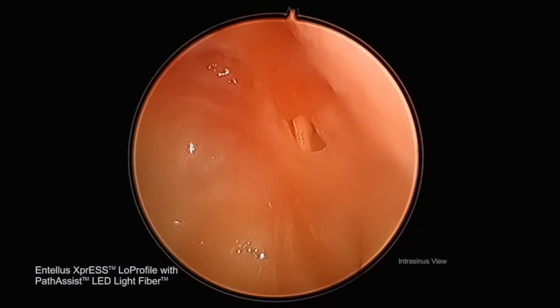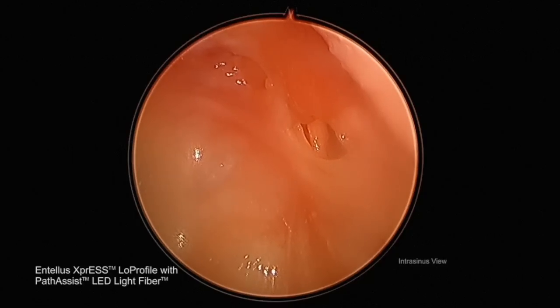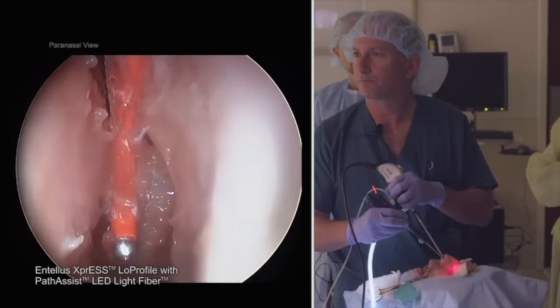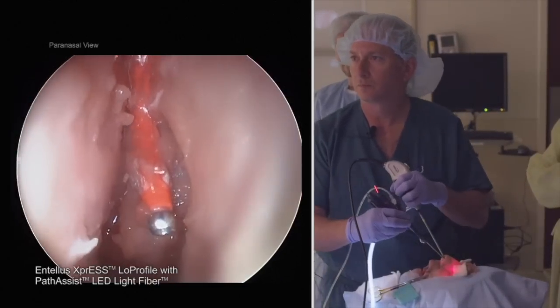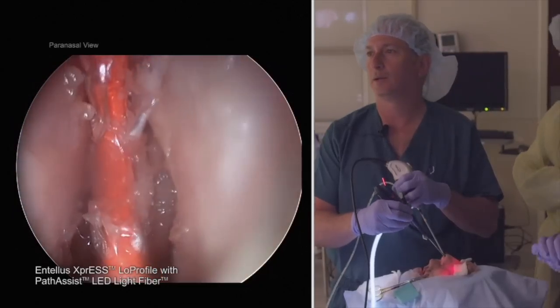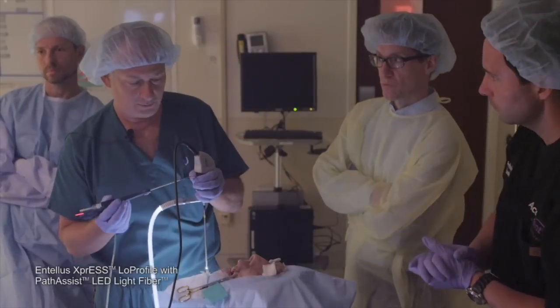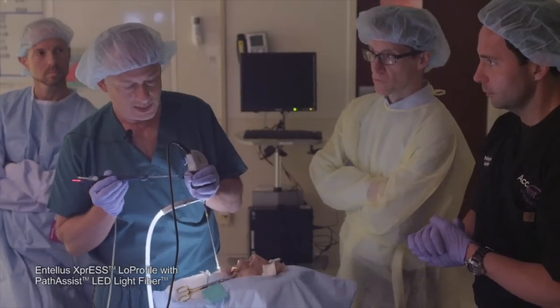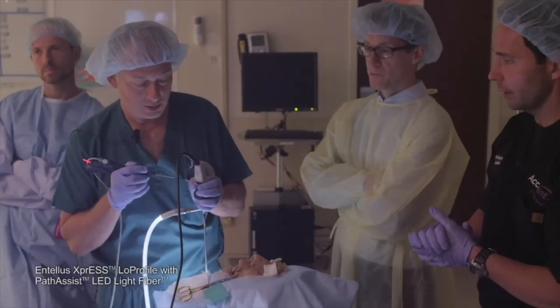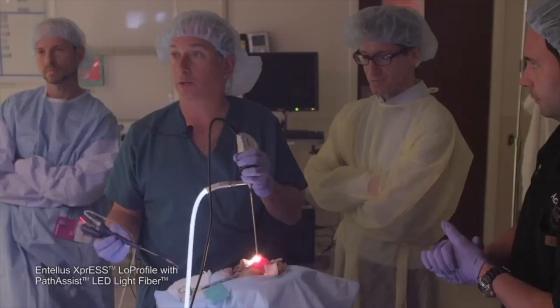You can clearly see that — it's just torn. So that was the first rotation; they did the maxillaries as well. How do your patients tolerate the difference in the balloons — the difference between the Clarin balloon? I like the Clarin better for that, because sometimes I feel like I don't have to go that close to where I need to be, and let the wire do the work, as opposed to having to go with the rigid instrument all the way to where I need to be.